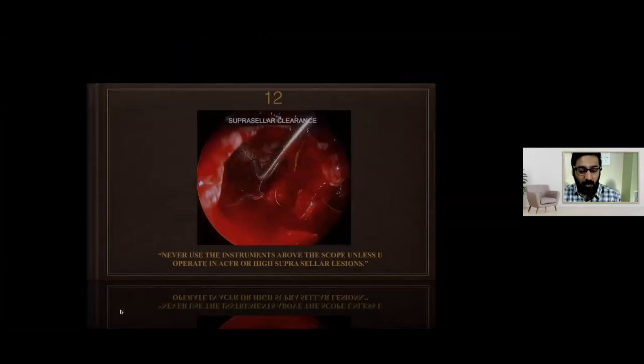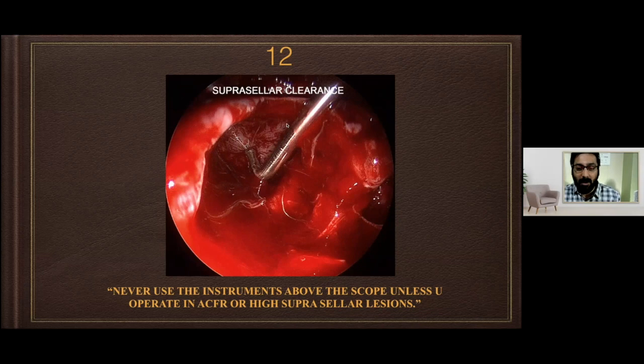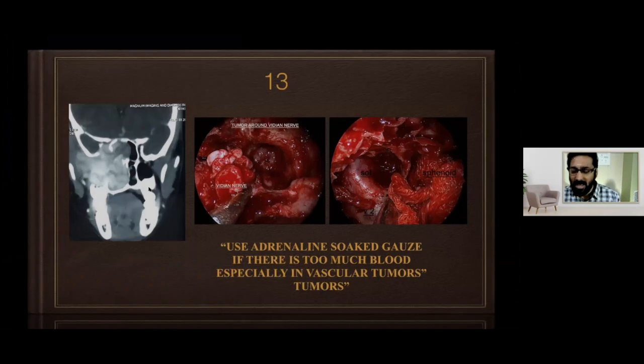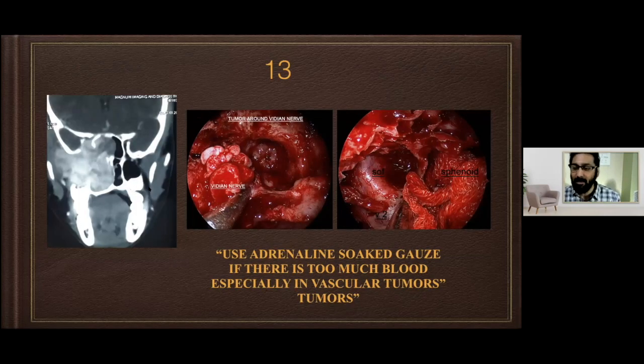Then if you go for the suprasellar, never use the instrument above the endoscope. This is again and again, I tell you, just keep seeing that. And in the nasal cavity, many people have a problem with bleeding. Many people say, I have so much bleeding when I do the nose.